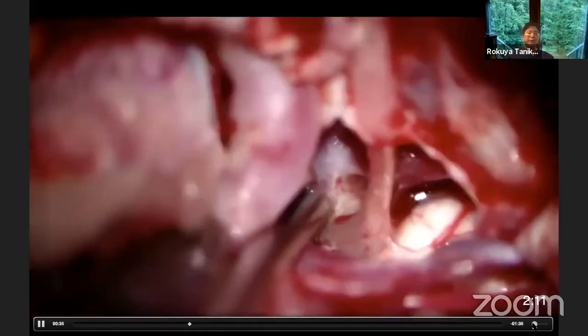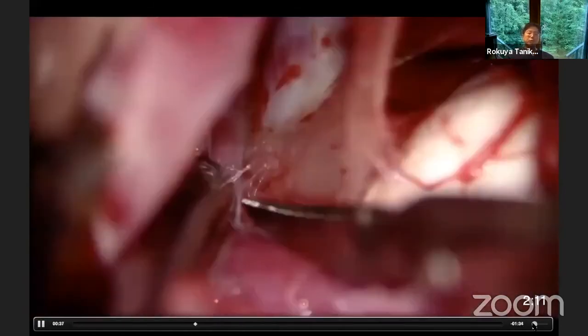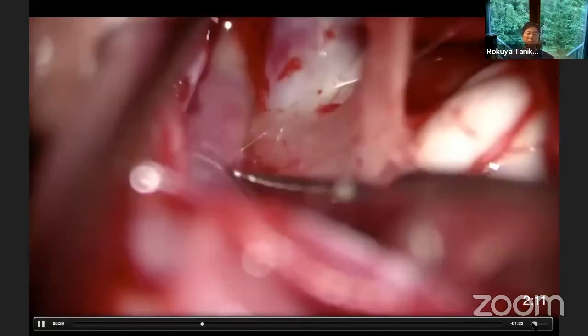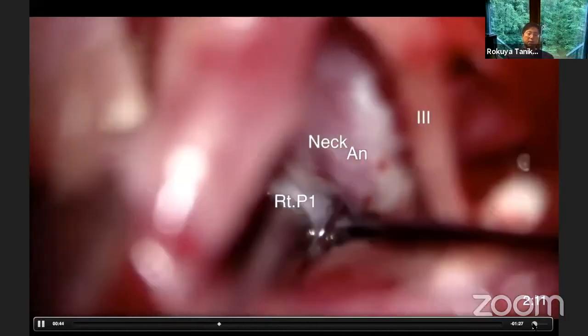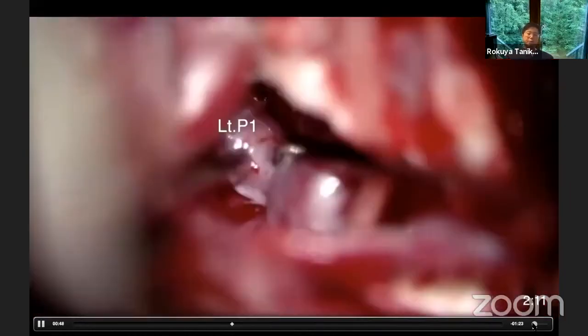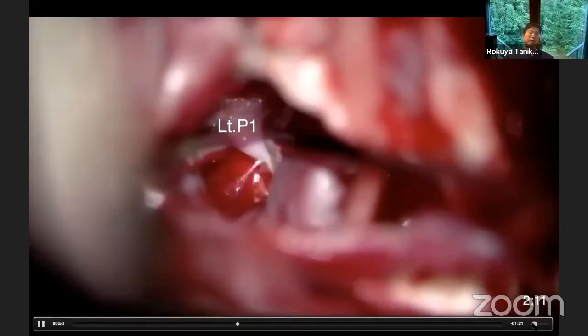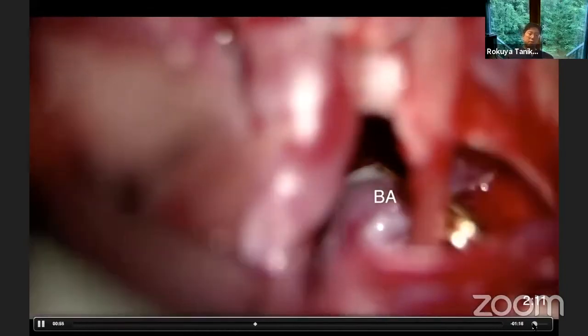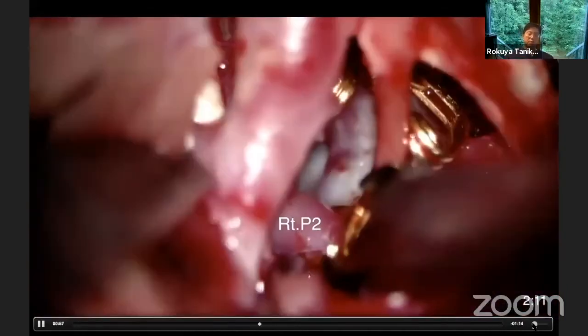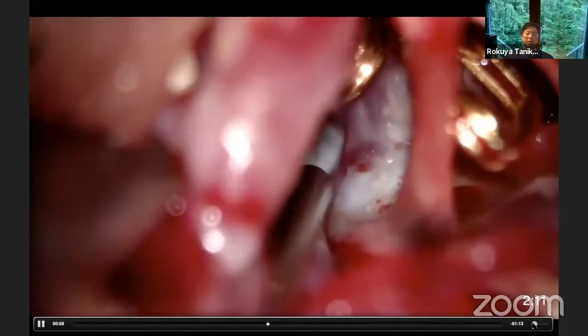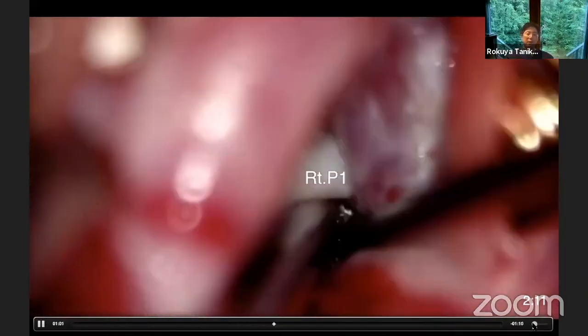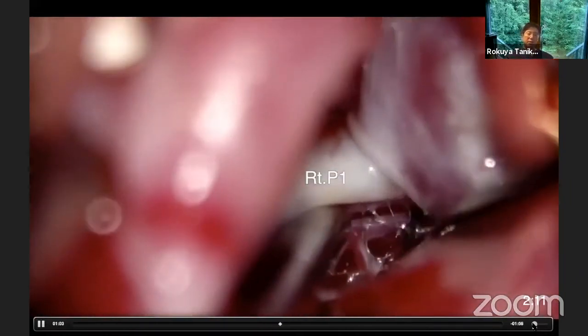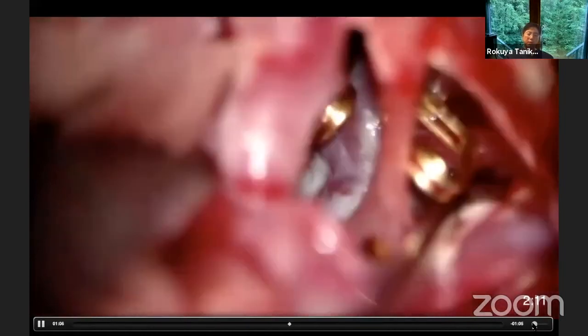This is the trans-sylvian and subtemporal route. I am confirming the origin and the neck of the aneurysm and the contralateral P1. This is the ipsilateral superior cerebellar artery. The contralateral P1 is identified, along with the oculomotor nerve. This is the right P2. Now I am dissecting the distal neck between P1 and the aneurysm.